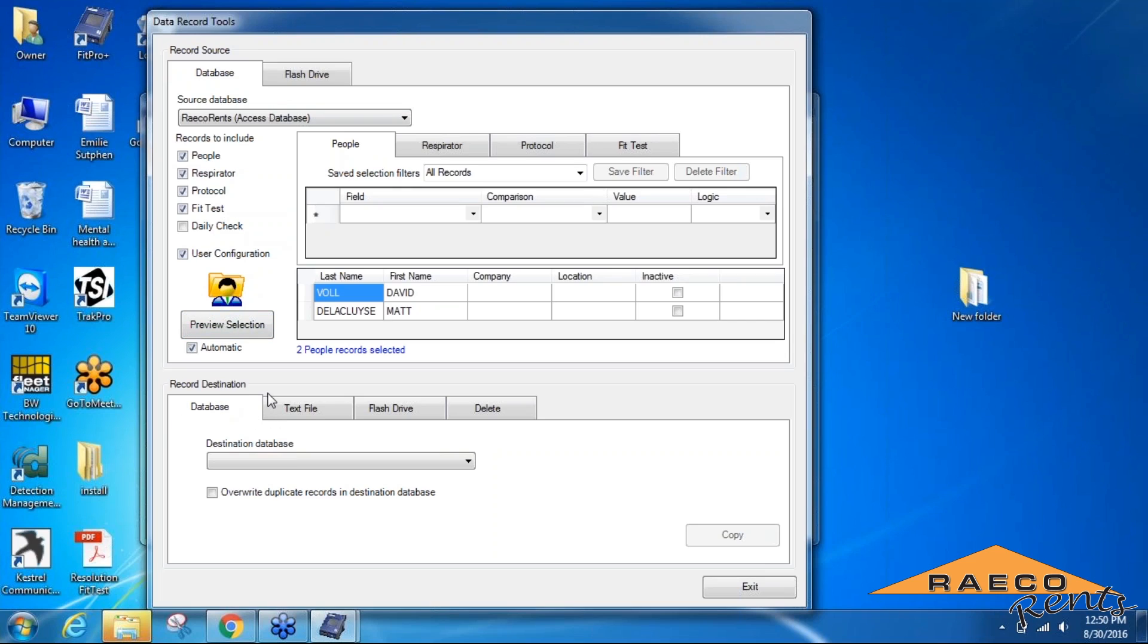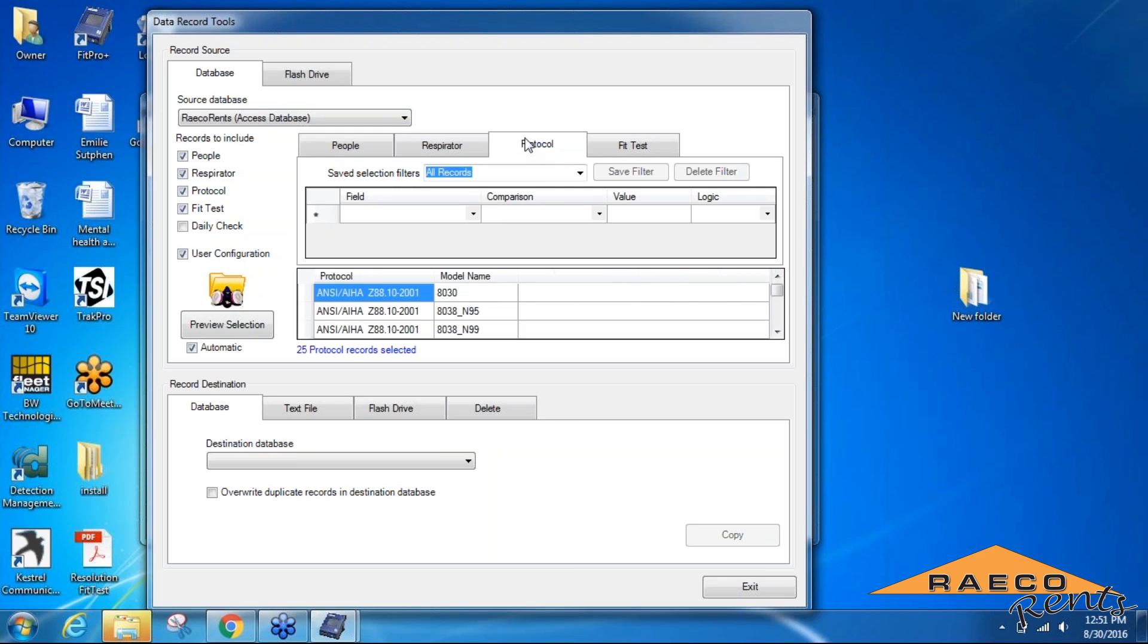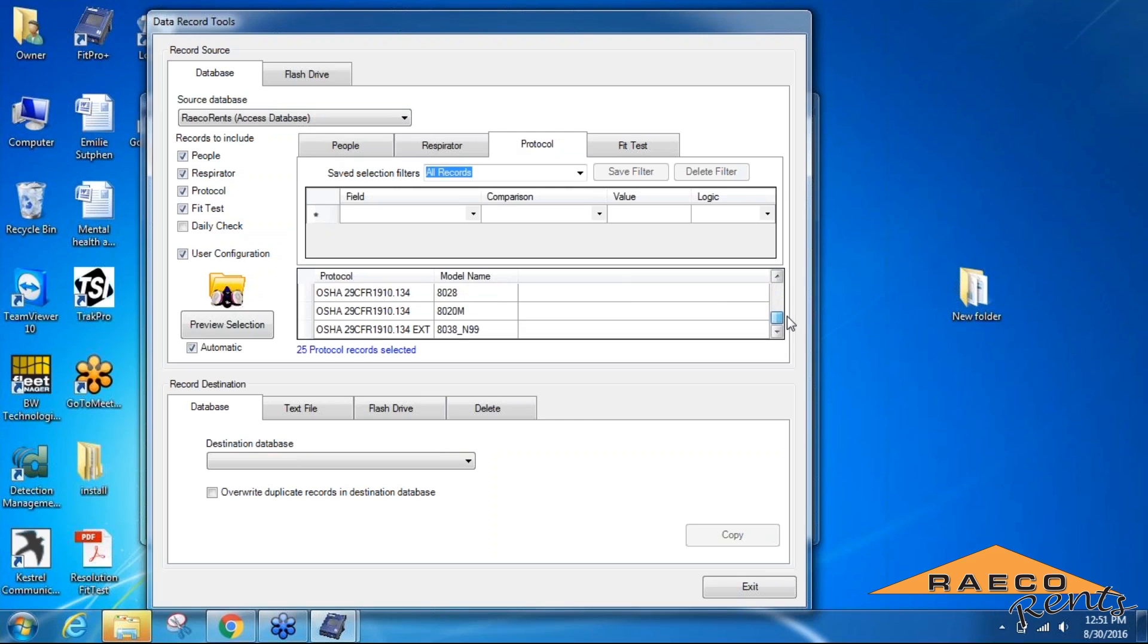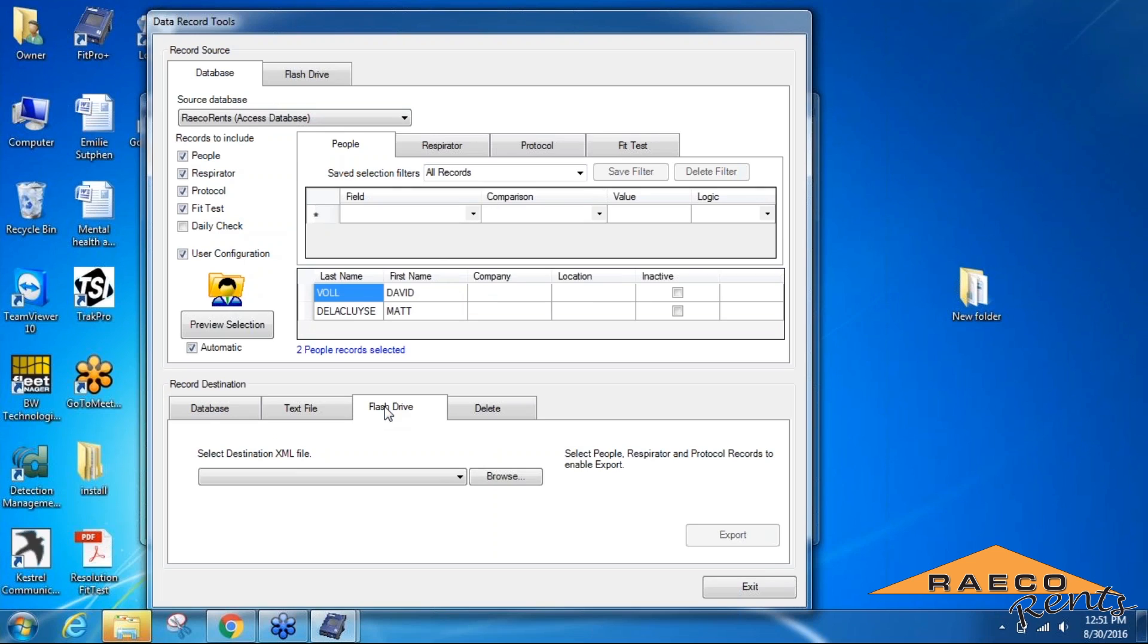You can look through and make sure that everything that you've saved is going to be transferred correctly. It shows up in this main section up here - you've got your people, respirators, and any available protocols including ANSI and OSHA.